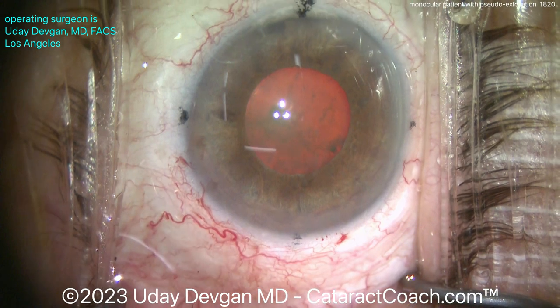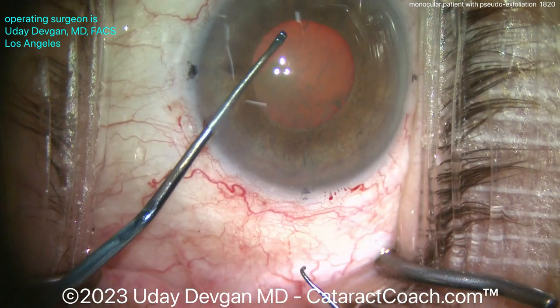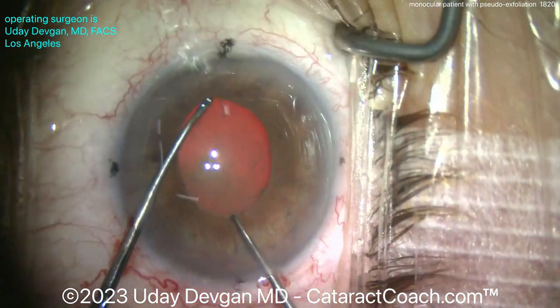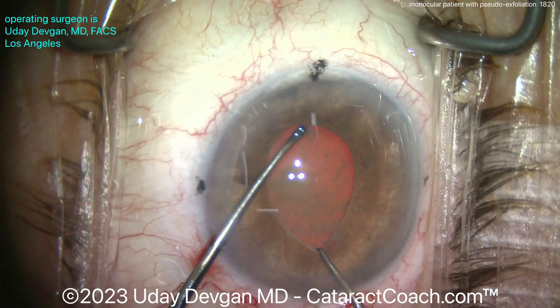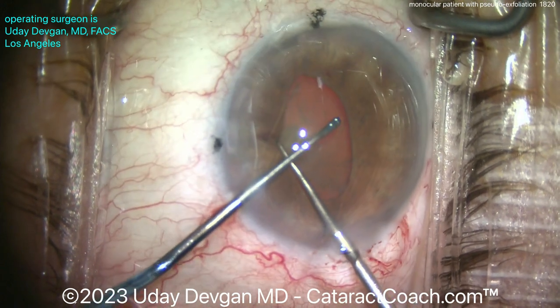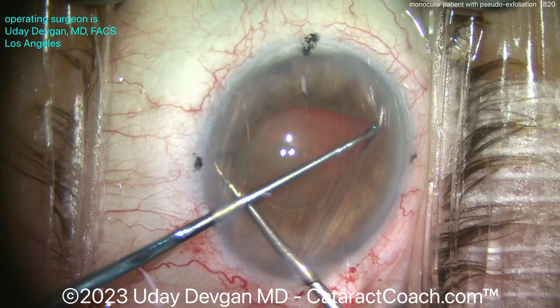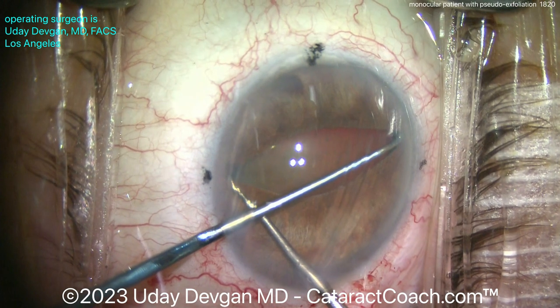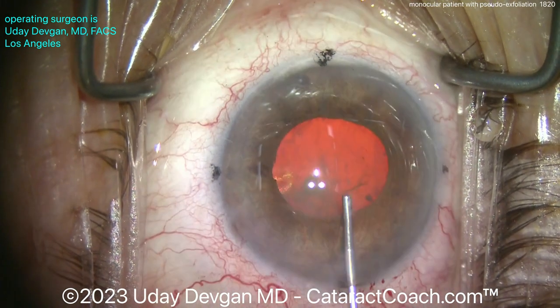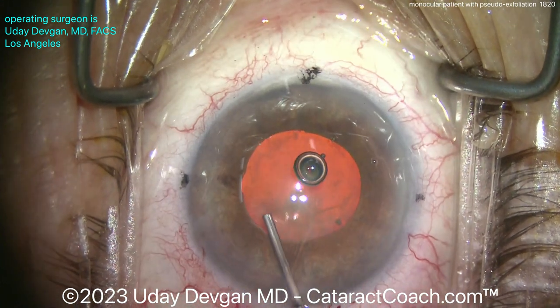What would you do now — pupil expansion ring or iris hooks? All are reasonable, but can you get away with doing less in a safe and efficient manner? I'm going to use a chopper in one hand and a Sinskey hook in the other and do a little pupil stretch. We did put anesthetic in the eye so the patient won't feel this. Be very cautious with that hook not to damage the anterior lens capsule — a fraction of a millimeter could cause a lot of problems. Now doing Osher's technique of viscomydriasis, pushing the viscoelastic in and getting that pupil expanded a bit more.